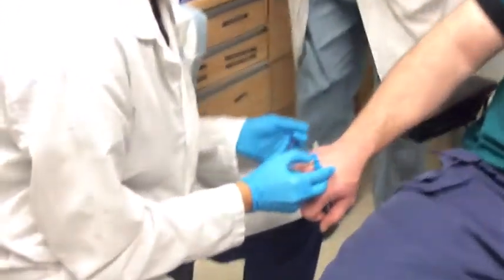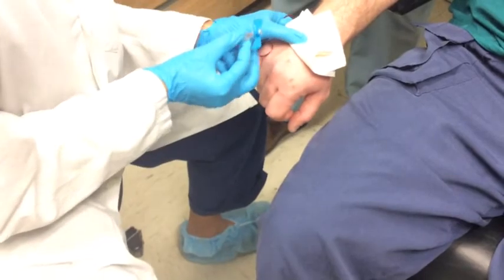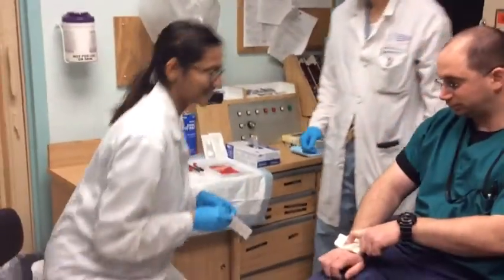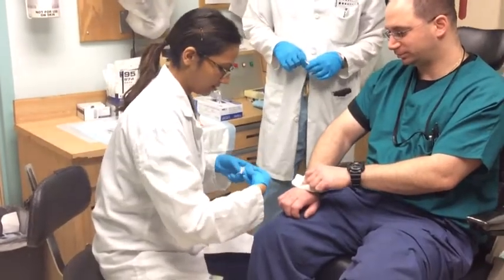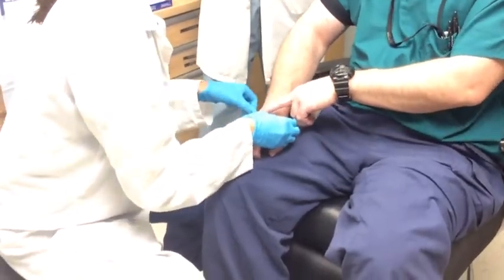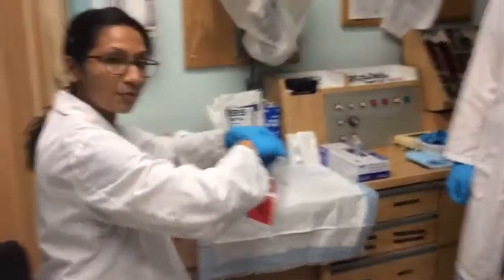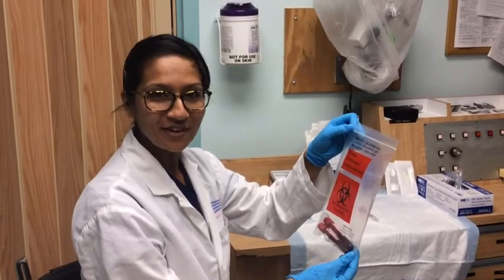Just hold some pressure there, and then we will go ahead and dispose of the sharps. We need some pressure there, and then we will go with a band-aid. So we have our tubes — we're going to put them in our bag here. Make sure to label these appropriately, and we're going to take these up to the lab. We will turn this video back on once we get upstairs.